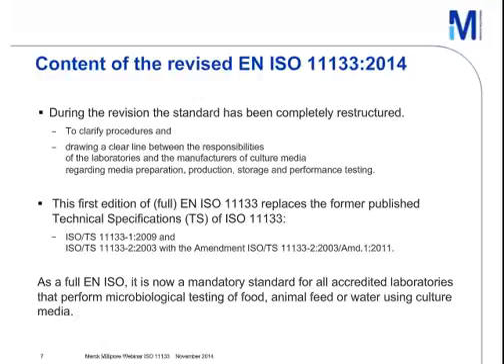During the revision, the standard has been completely restructured to clarify procedures and to draw clear lines between the responsibilities of the laboratories and the manufacturers of culture media regarding media preparation, production, storage and performance testing.